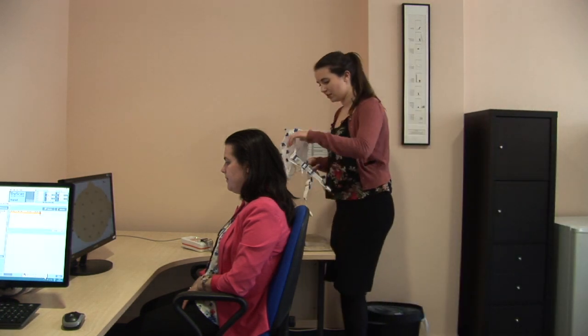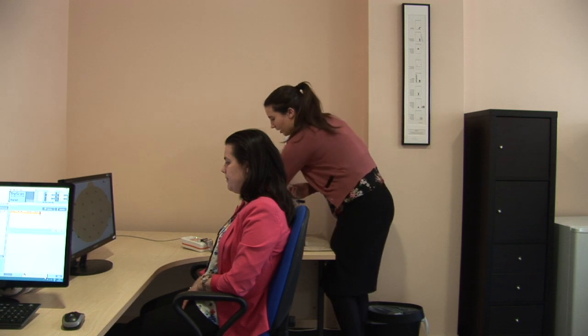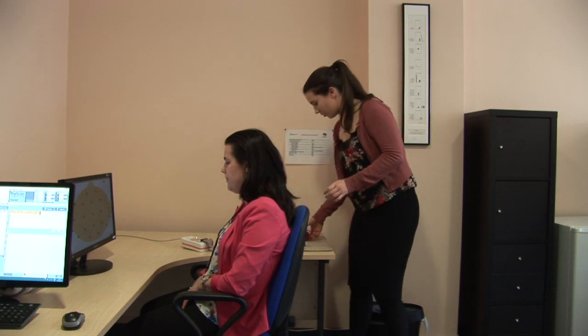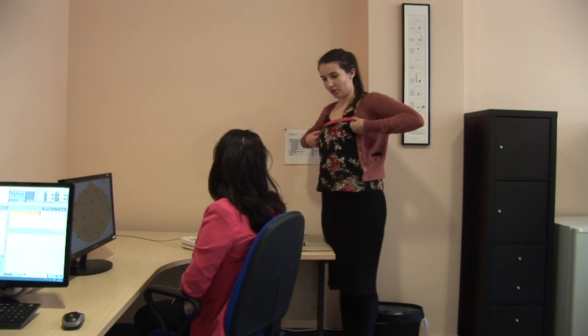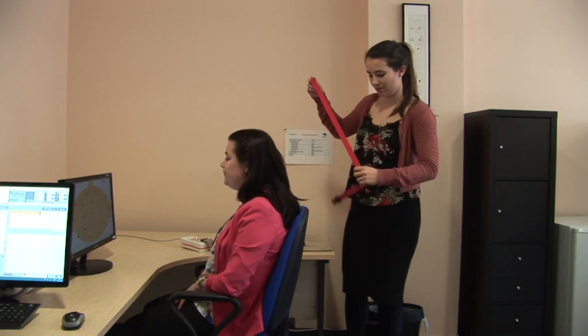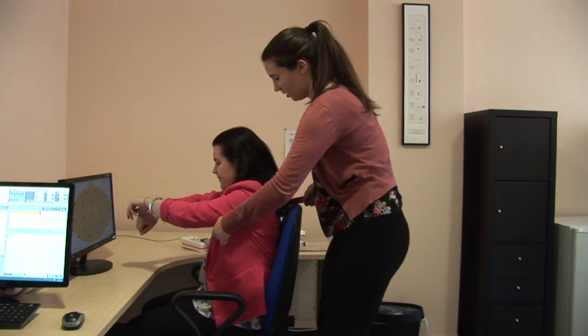Okay, so this is our EEG cap. Monitors your brain activity completely passively, the same way that a heart monitor would. And the first thing I'm going to do, if you just turn around and have a look at me, I'm going to put this across your chest like this, and that's just to keep the cap in place, okay? Cool. So if you pop your arms up over that for me, that's perfect.